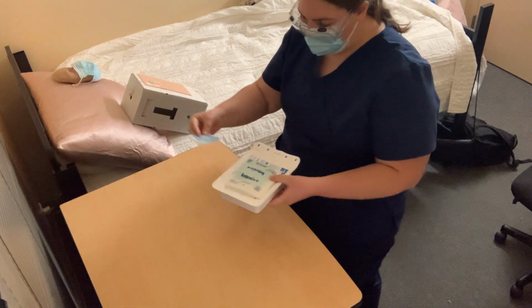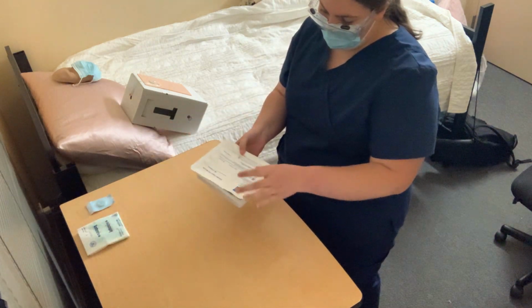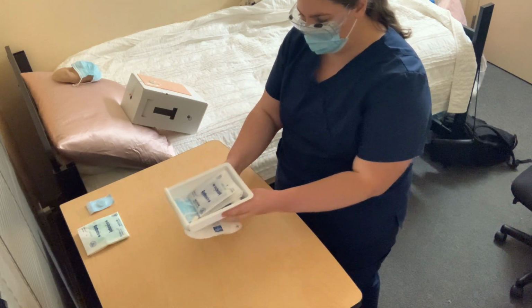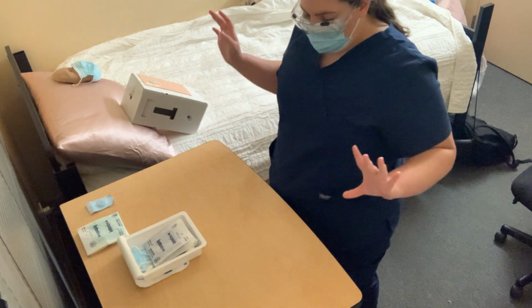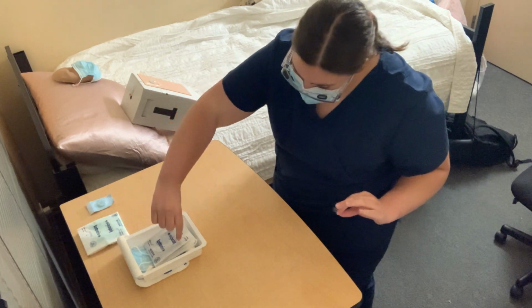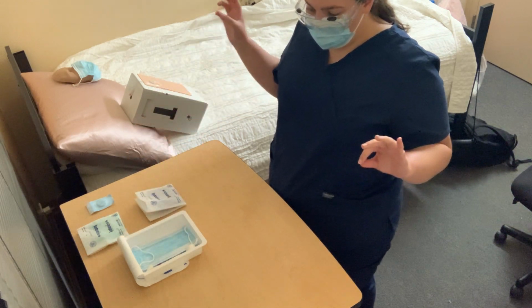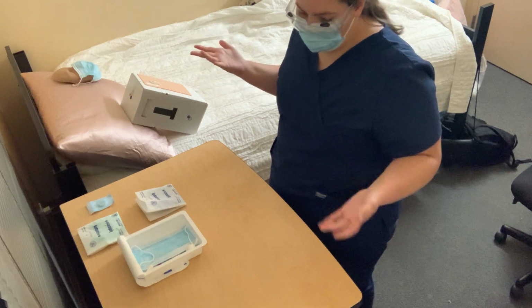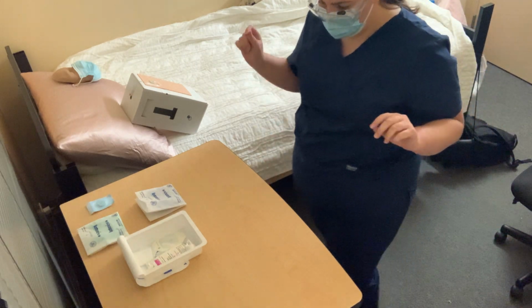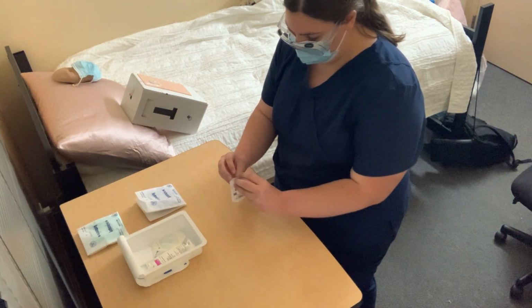So first I have my bio patch. I have an extra pair of sterile gloves just in case I need them. And I have my central venous catheter dressing change tray, which I'm going to go ahead and open up. And then since I've done hand hygiene, I can go ahead and grab the sterile gloves out of the packaging, just touching this outside paper. And then I'm also going to grab the mask inside of the tray since both my patient and I already have a mask. Next, I'm going to take the bio patch and open it up and place it into the tray.